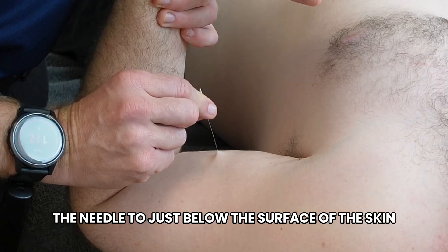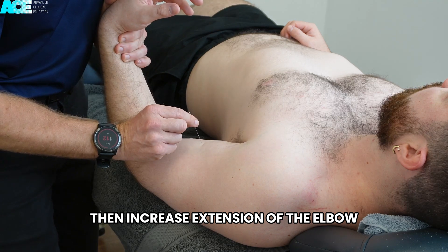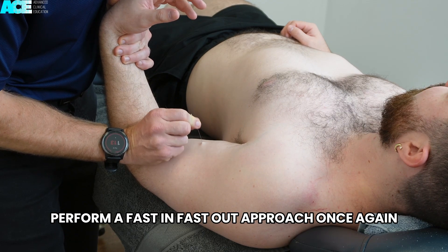Then withdraw the needle to just below the surface of the skin, within the subcutaneous tissue. Then increase extension of the elbow and reinsert the needle. Perform a fast in, fast out approach once again.